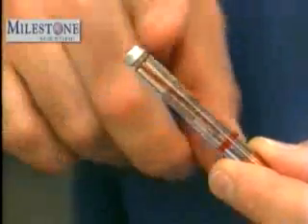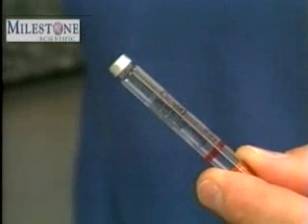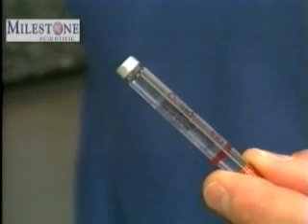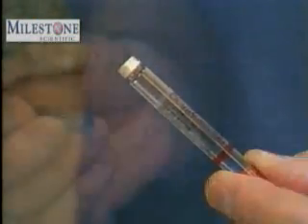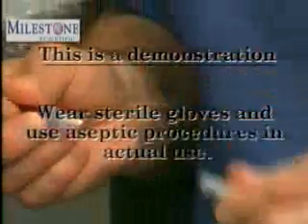Recommended dosage is from 3/4 to 1 full cartridge, which will require 3 minutes or more to deliver, achieving a duration of from 60 to 90 minutes. Use a 30-gauge half-inch needle. Set up the wand as usual.